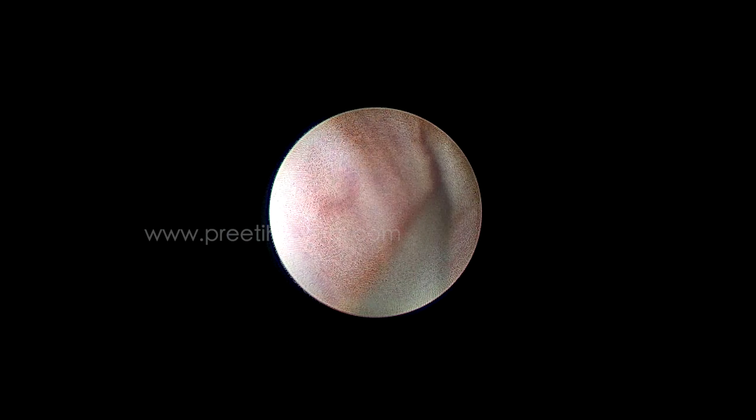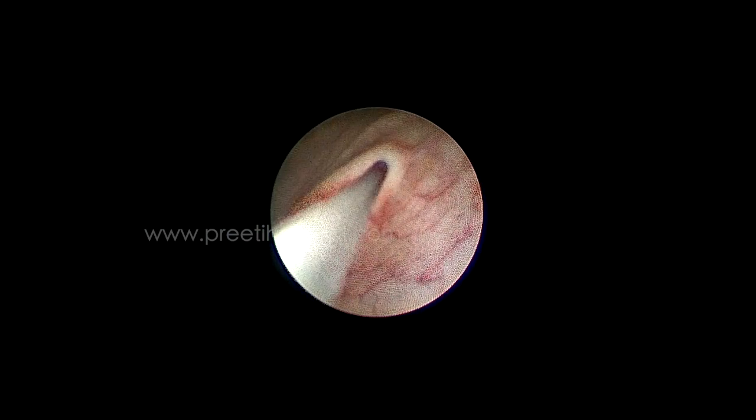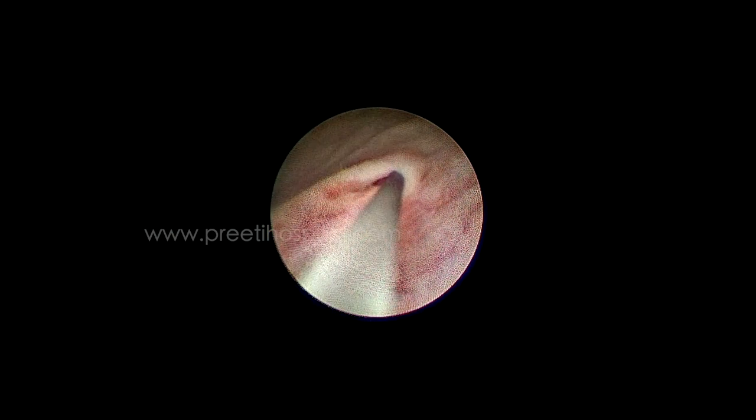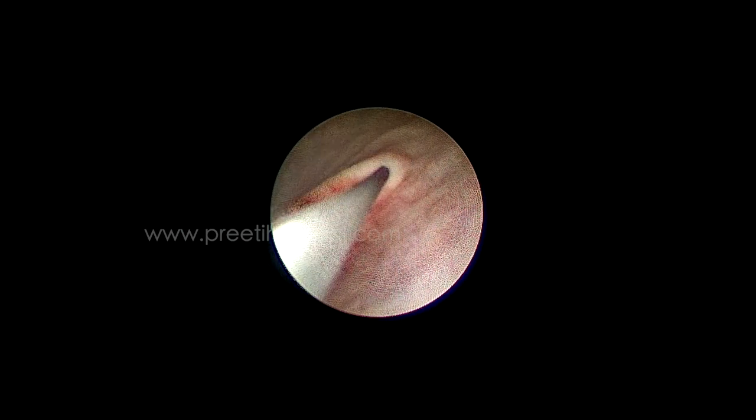This is because of the 5-degree angle of most ureteroscopes. Also, if you enter like this, the shearing effect will be there. You have to turn externally without turning the camera. Hold the camera and ureteroscope — you have to turn.